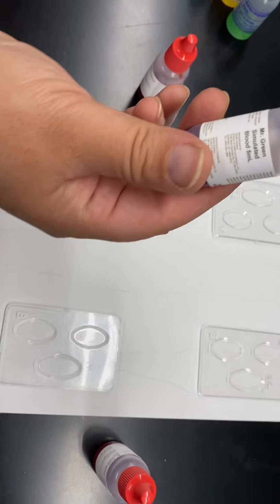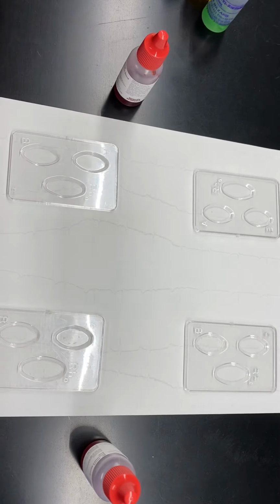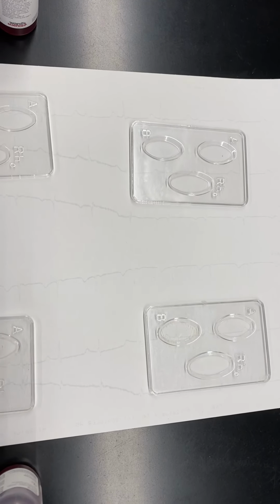So what I'm going to start with is Mr. Green's blood sample. So I have these trays. Move this one upside down. If you can see in the video, there is a letter A up here, a letter B down here, and letter RH right here. And it's present in all of our trays. It's basically identical. So I want to see if Mr. Green has antigen A, antigen B, or antigen RH present on their blood.